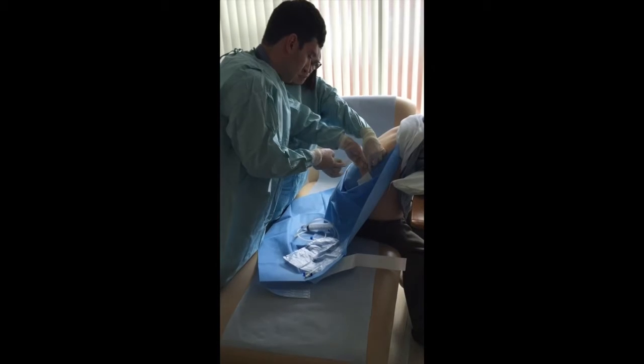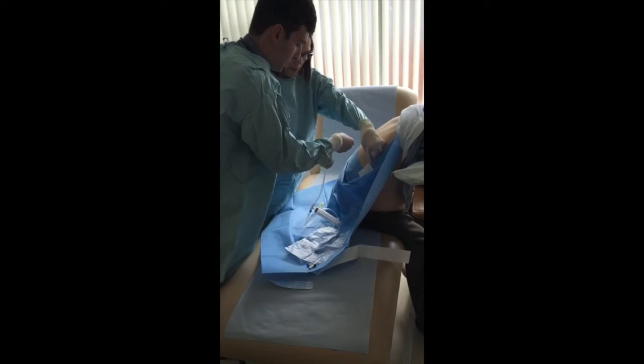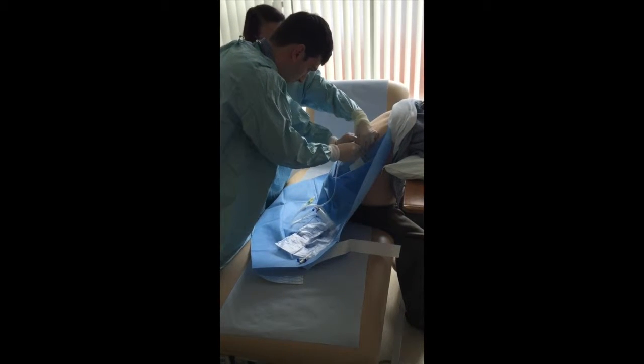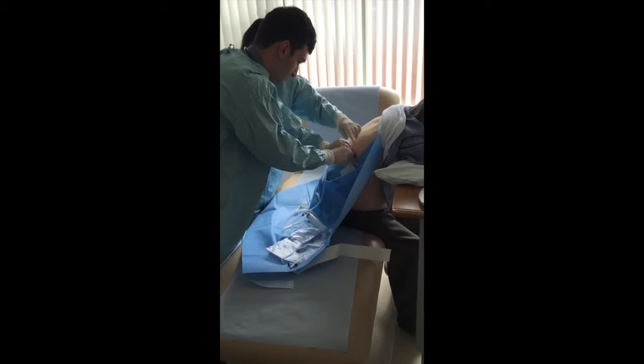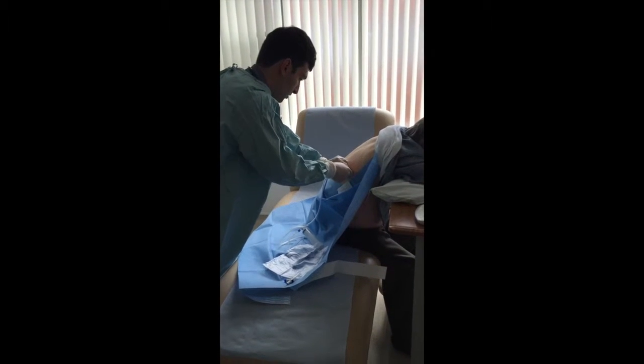You're going to put your thumb over the end. And you're going to get the connection on the bottom of here and attach that over to the cannula. Okay, you ready? And that's just a luer lock, so just turn the connector around, okay? And just hold the cannula because you don't want to lose the cannula there.